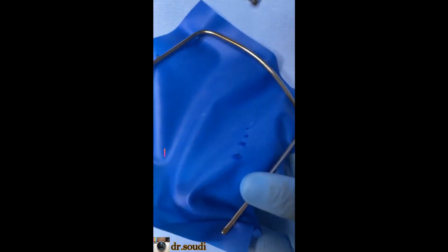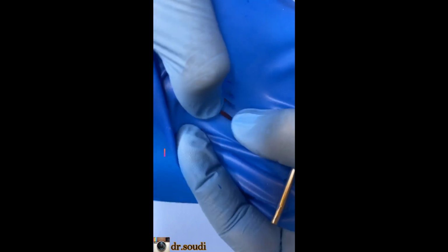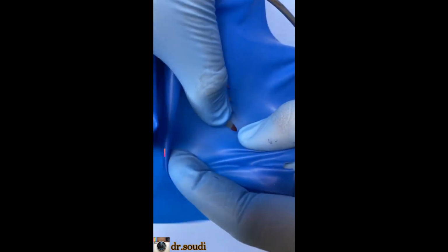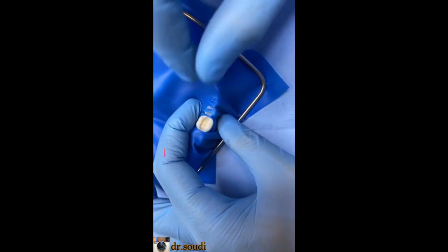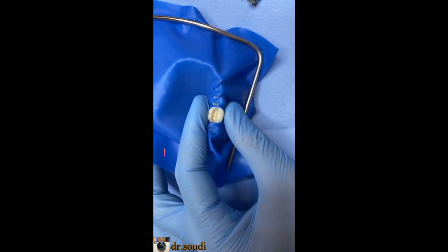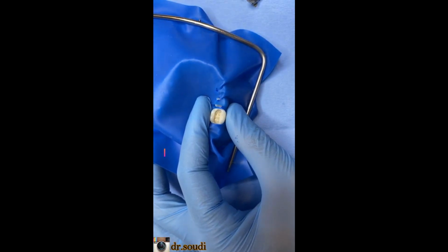There are many techniques for this. We can use this as the single one. We can stretch it like this, stretch it like this, and place first the tooth which you will clamp, then complete it. Okay, this is the first technique: sheet and frame, then the clamp.